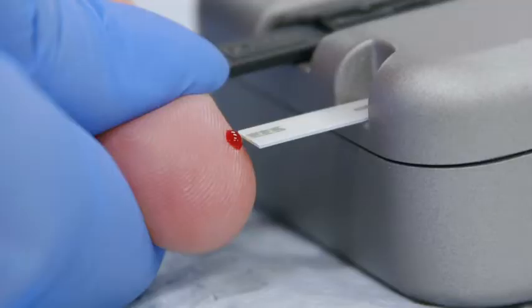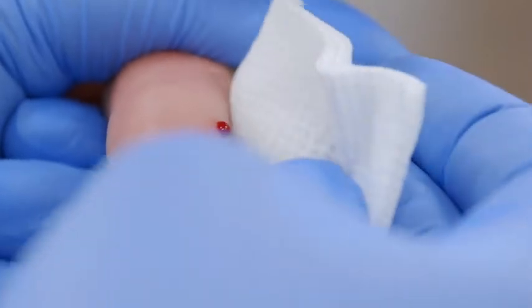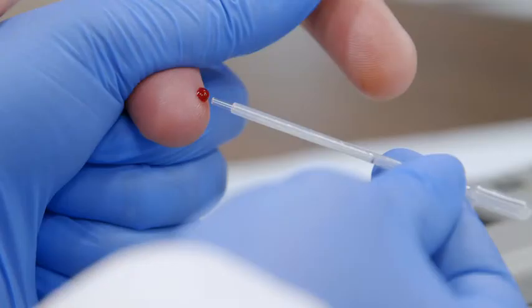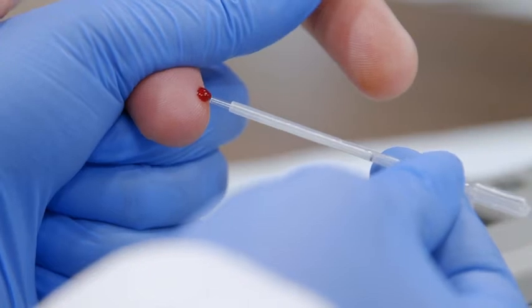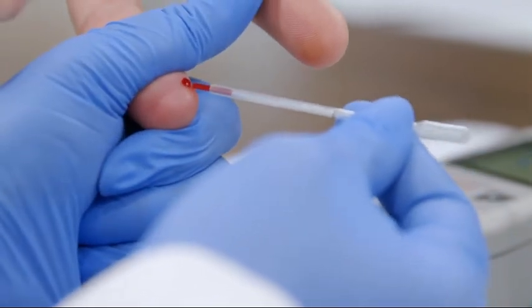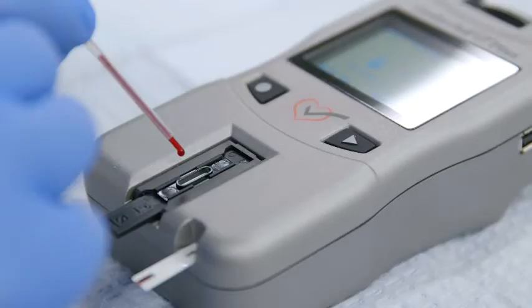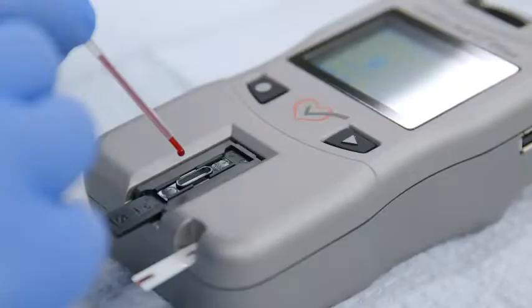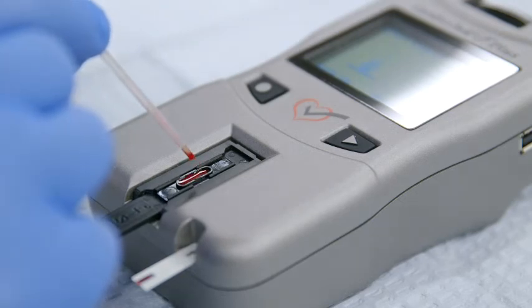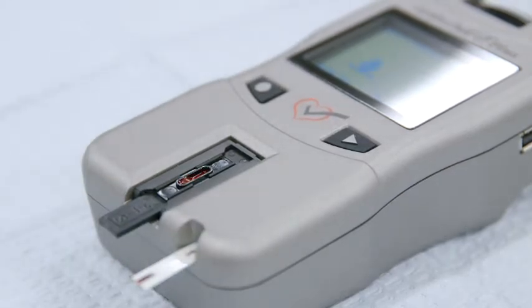Apply the sample to the eGlue test strip first. Touch the blood drop to the tip of the strip. Wipe away any blood remaining on the fingertip with gauze. Then collect a second blood sample for the lipid panel test strip with a capillary tube. The blood drop should be hanging down from the finger to make it easier to collect. Gently apply intermittent pressure to the finger until you've drawn the appropriate amount of blood. To dispense the blood sample, hold the bulb of the capillary tube placing your fingers over the two small holes. In one gentle, steady squeeze of the bulb, dispense the entire sample onto the strip. Be careful not to touch the tip of the capillary tube to the test strip. Once you've applied the sample, do not move the analyzer until the test is complete.